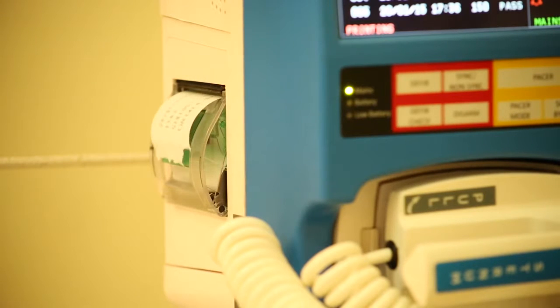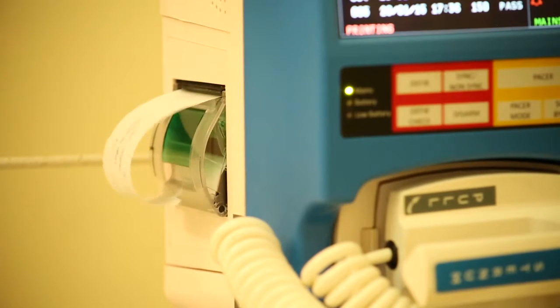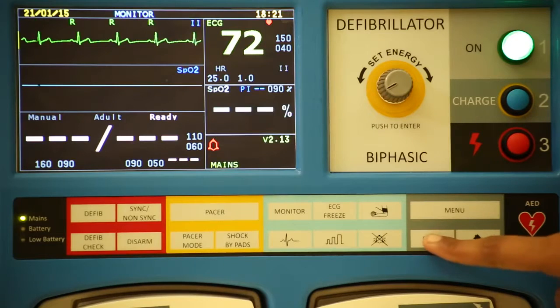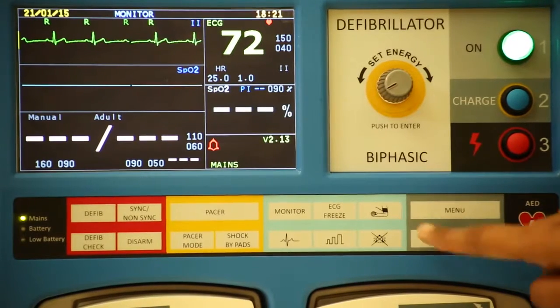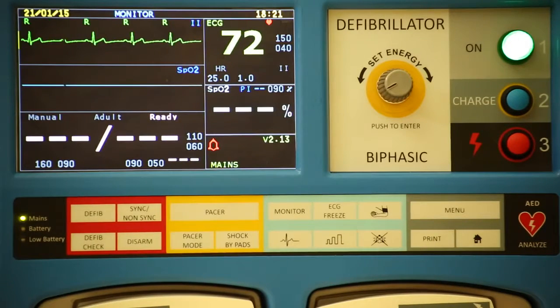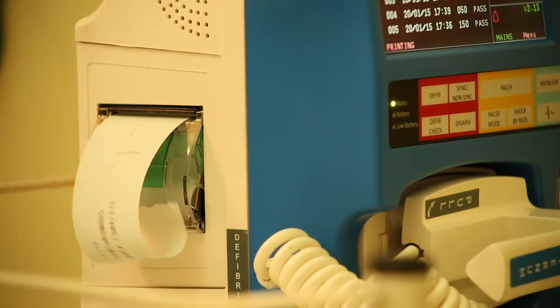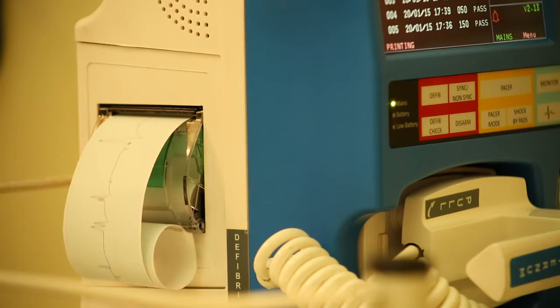Pressing the print key in defib mode, unit prints the last 10 seconds of ECG data with time, date, energy, shock status and mode name. A manual print of an event can be obtained by pressing the print key. In monitor mode, the unit prints the last 10 seconds of ECG data with time, date, selected lead name, gain and sweep speed.